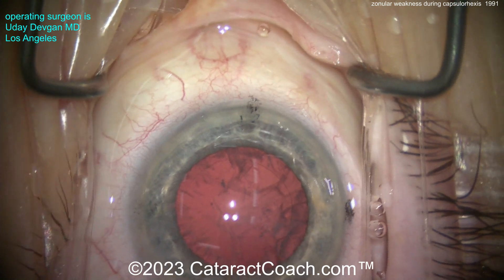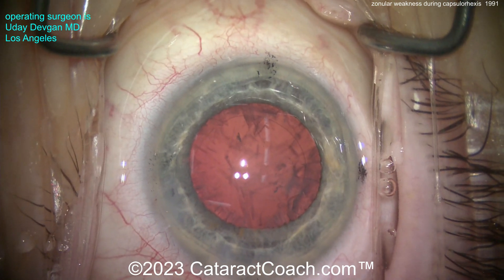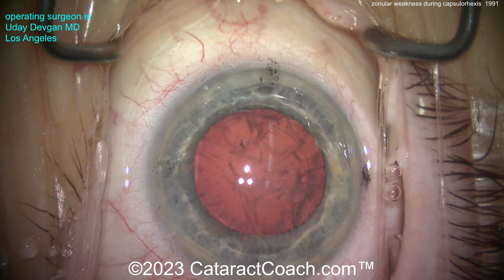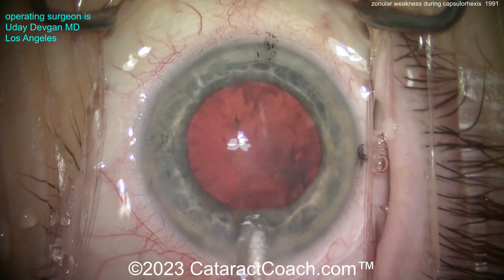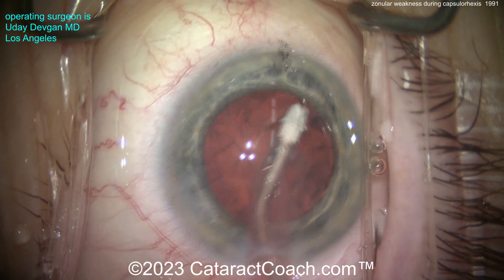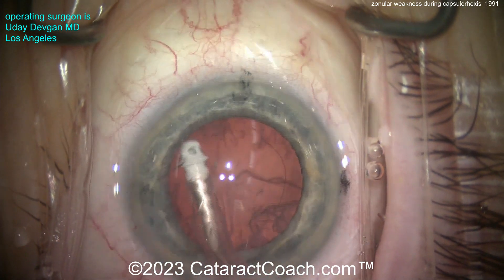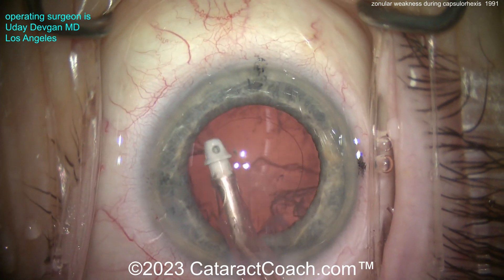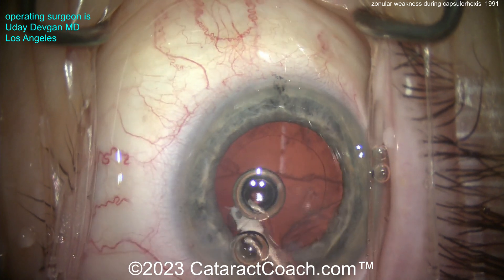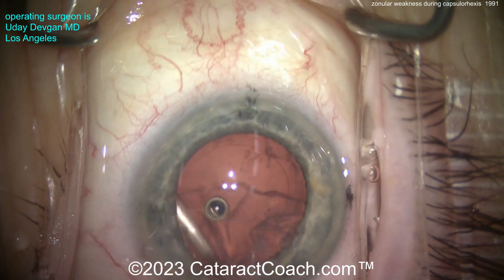Cortex removal is an important step that gives a lot of hints. Watch carefully as you do the cortex removal, and look at the rhexis edge. If the rhexis edge moves during cortex removal, that's obviously not a great sign — it means the zonules are really bad. But as we take out the cortex here, look: the edge of the rhexis is pretty much rock solid and doesn't really move much. We'll finish up the cortex removal here.